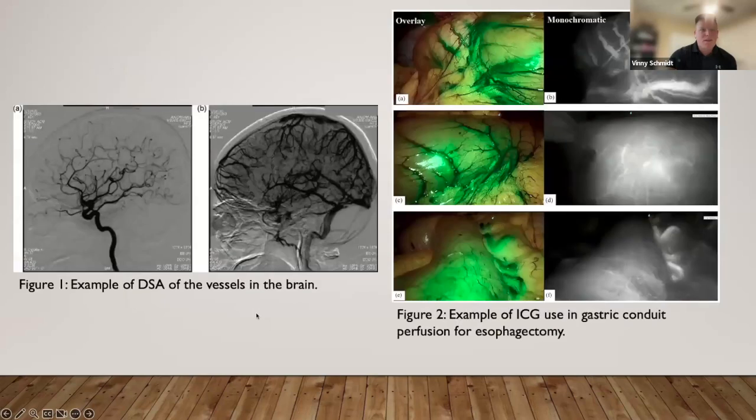To extend off that, here on the left, this image is digital subtraction angiography of the vessels in the brain. Especially in a fluoroscopic setting, when someone has a STEMI, radio contrast dye is injected into the coronary vessels. You can picture the outline of the heart a little bit. You can detect if there's any stenosis. You can see if there's any aneurysms, etc.